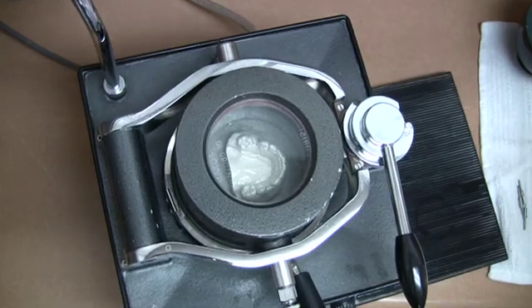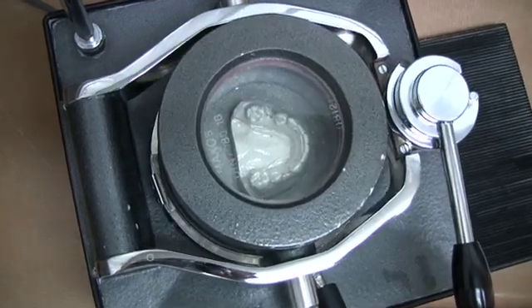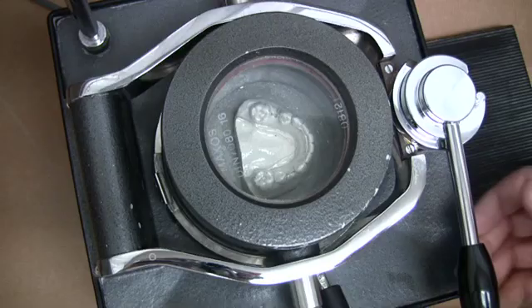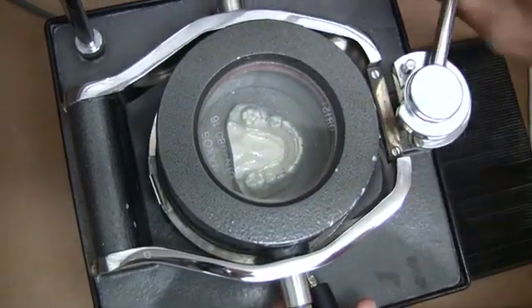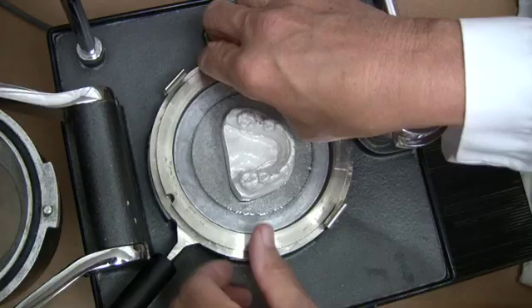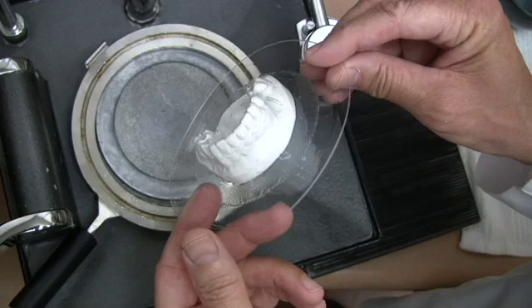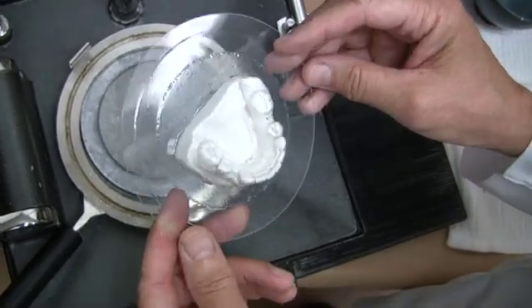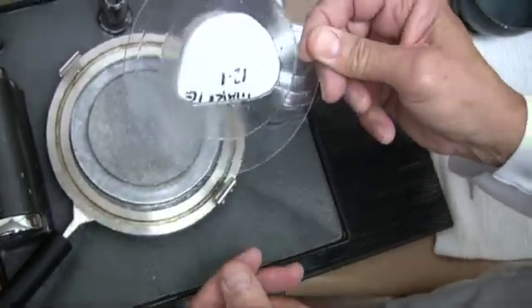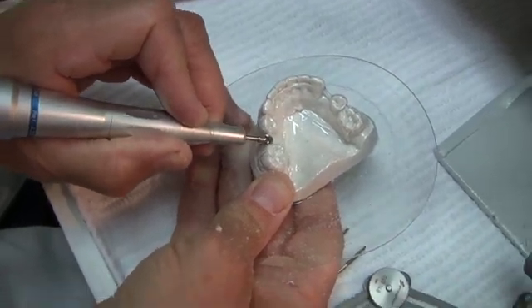If you do not have a Biostar, any other vacuum molding machine will suffice. The A.040 material will be molded to the model with the Biostar machine. After removing the model, there will be a slight wrinkle in the guide over the planned implant site. This always occurs and is removed with the .05 round acrylic cutter.